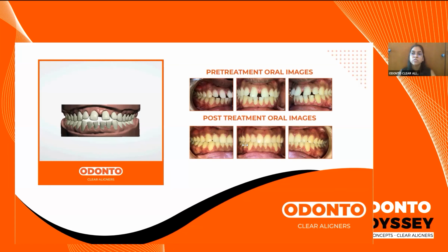Once you are through your aligner treatment and you're satisfied with the results, that this is the end of it, then you will have to place your bonded retainer. You will have to fix that retainer, then take a fresh scan and ask for a clear aligner retainer to be fabricated on top of the fresh one.